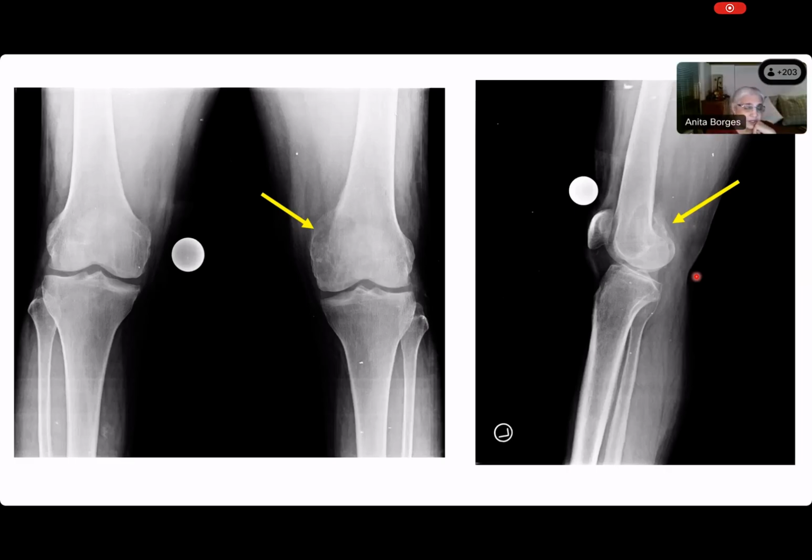Isn't that right, Sarangi? Yes, ma'am. So is the zone of transition, and you see the zone of transition here? Yeah, sharp zone of transition. Yes, ma'am. There seems to be that. I mean, there may be something in the posterior aspect of the femur, there may be a small soft tissue extension. Very difficult to say over here, but the transition between the bone and the lesion is very sharp. You can see that.